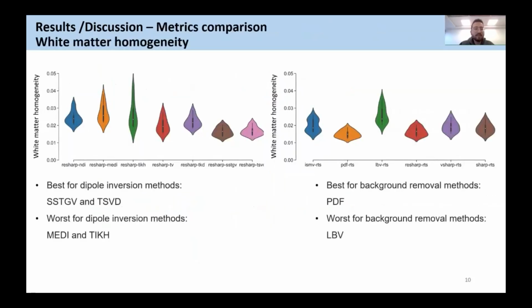Now, let's compare the quality of the reconstructed images. If we assume that the white matter of QSM images should mostly be homogeneous if the processing pipeline is reliable, we calculated the standard deviation of mean susceptibility in the white matter area, using a template to identify this region, to determine white matter homogeneity. Low homogeneity, or high standard deviation, is a probable sign of low spatial frequency artifact and residual background phase components.